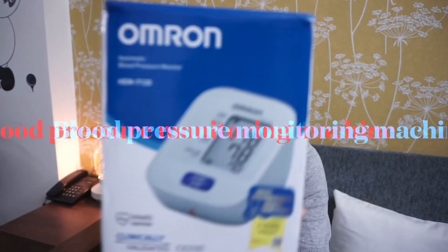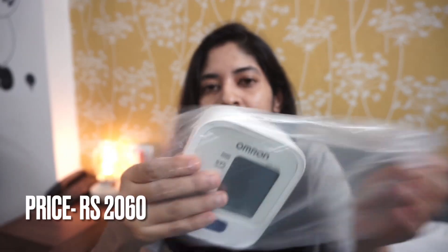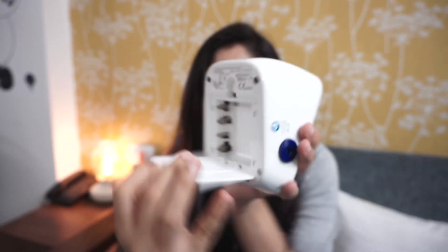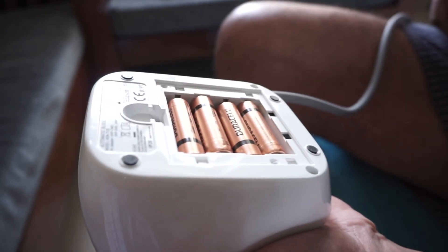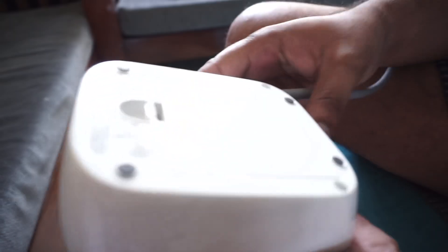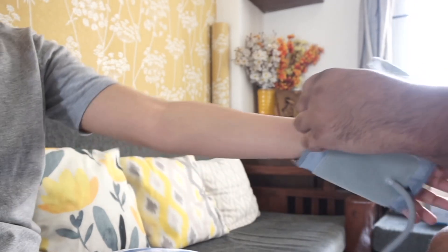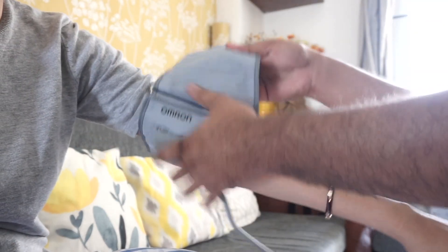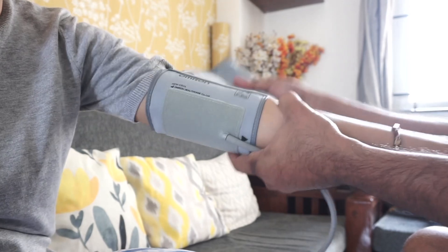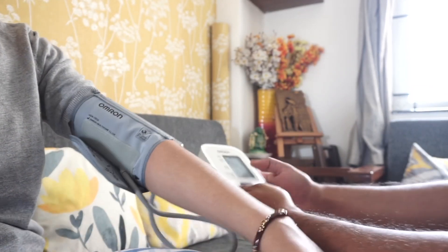Last but not the least is this BP machine from Omron. This is a blood pressure monitoring machine which comes with the machine and also with a belt which you can wrap around your arm to get your blood pressure reading. It operates on four batteries and also on an electrical input, for which you need a wire. You just have to connect it to your arm and then operate the machine — it is automatic.